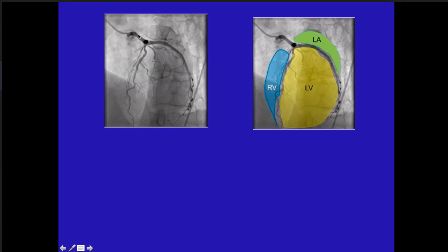And why is it cranial? Because you're looking at it from above and the diaphragm is seen. Now, although those ribs and clavicle and everything are useful, when you interpret an angiogram, they are not visible. So you must learn to identify RAO and LAO based on the shape of the heart, the position of the spine, the amount of heart behind the spine, and whether the diaphragm is visible or not. These are the clues to identifying the projection. That's the foremost point in describing an angiogram. You must know what the view is.